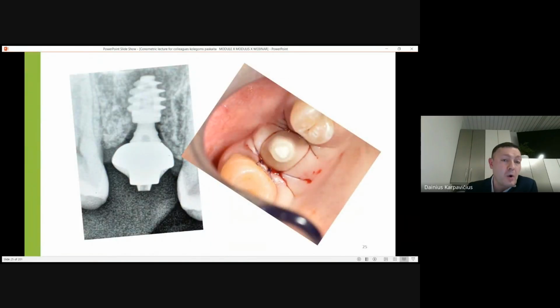So what is our goal for today? We can go two ways during surgery. Either put the implant and put all that is necessary later on: primary abutment, secondary like a gingiva former, and leave the implant open healing, if we found good primary stability of the implant and we are sure that during these couple of months of osseointegration this implant will survive.